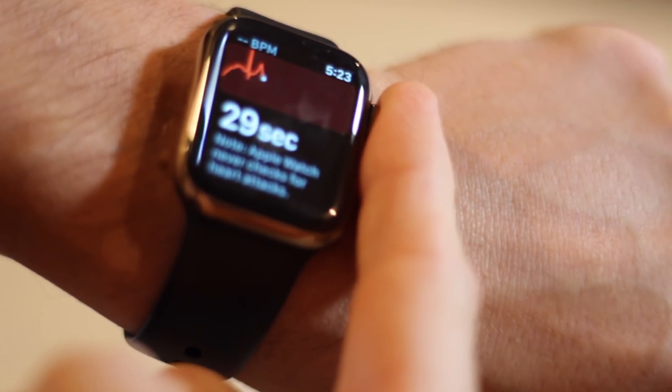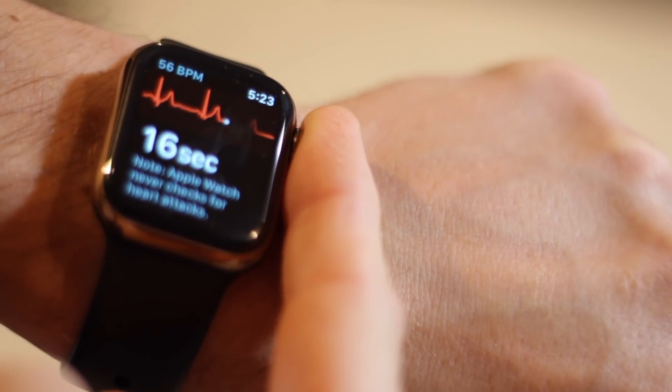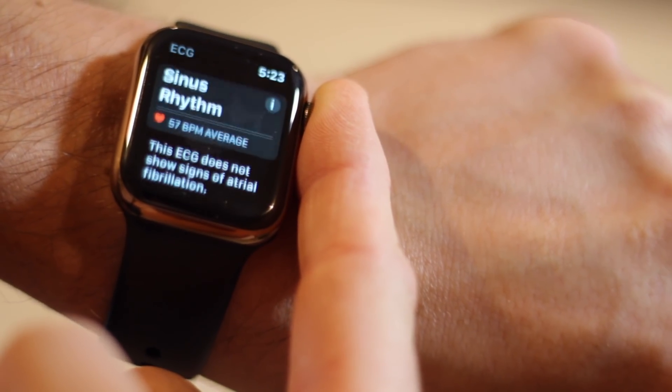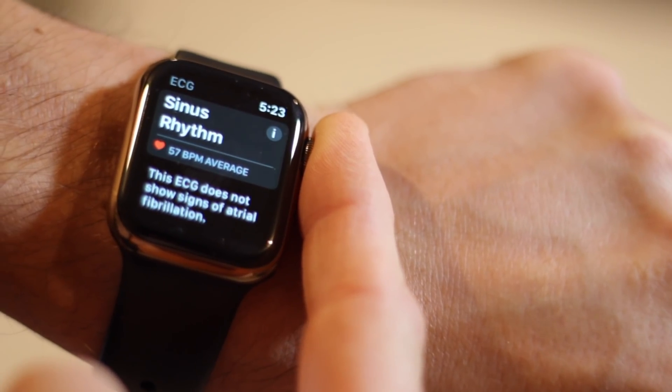If prompted, confirm your wrist preference and then place your finger on the Digital Crown. The entire test takes 30 seconds and shows each beat of your heart as it records its data. After the reading is complete, you'll see a basic summary which, assuming everything is normal, should read 'Sinus Rhythm.'